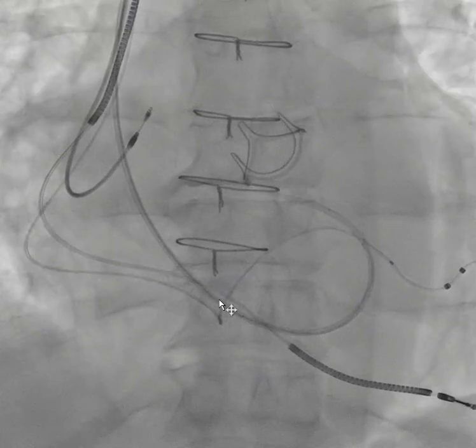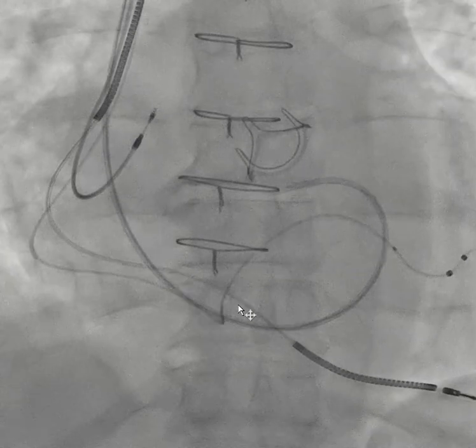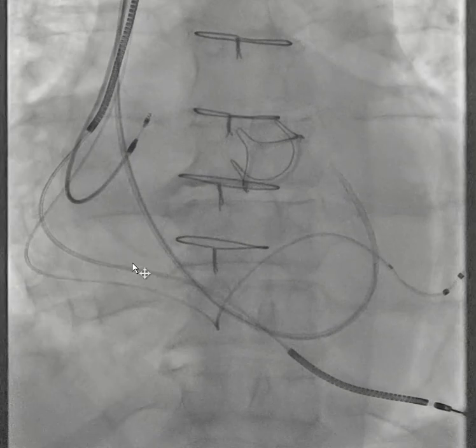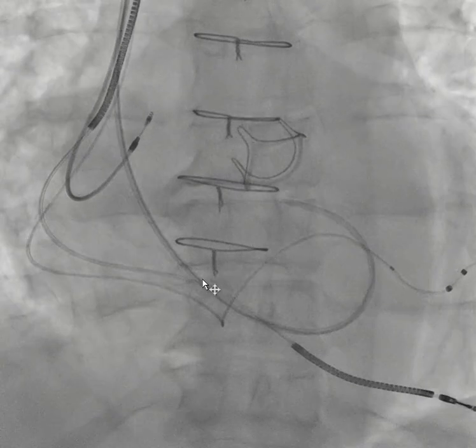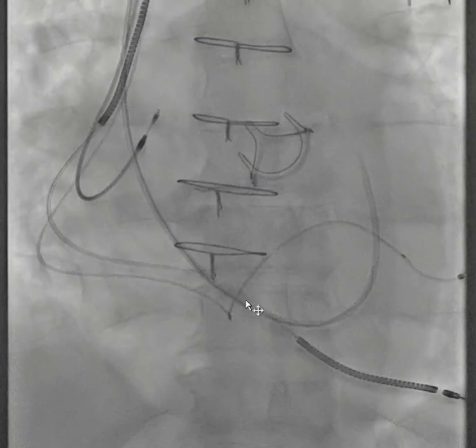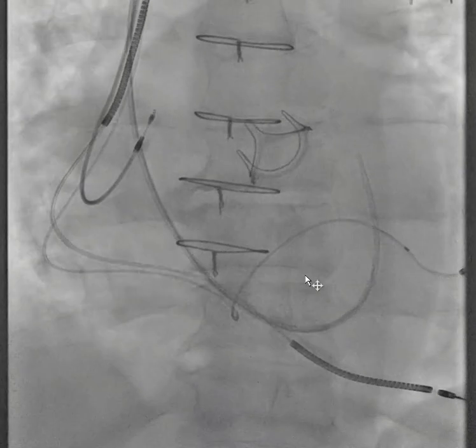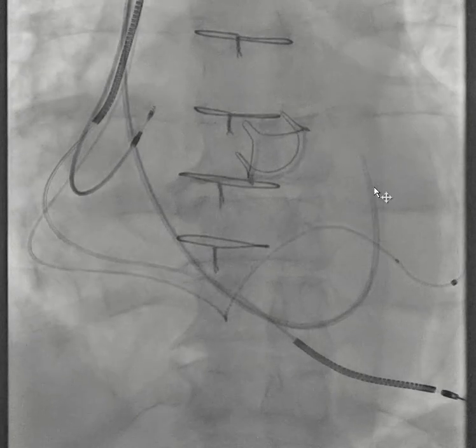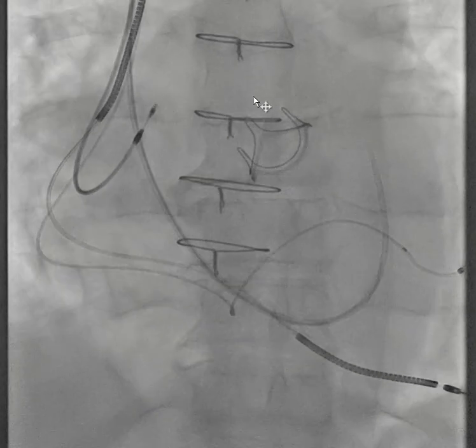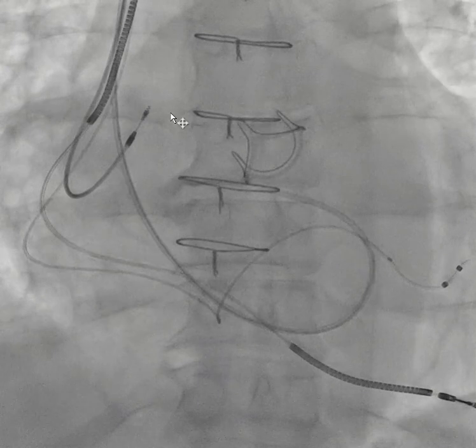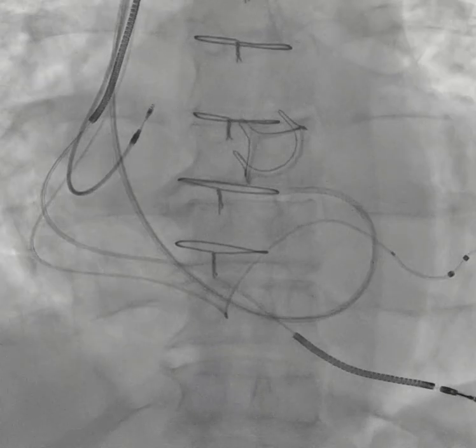There is wide-open tricuspid regurgitation here. As you can see, the bend in this pacemaker or defibrillator wire indicates where the annulus is — that's how you find out where you need to go and advance beyond it. Once I had this, the wire was parked in the pulmonary artery and I was able to get a sheath down and perform the biopsy.